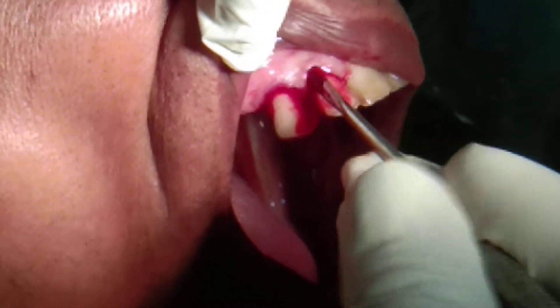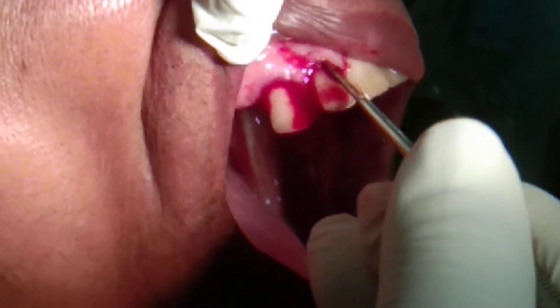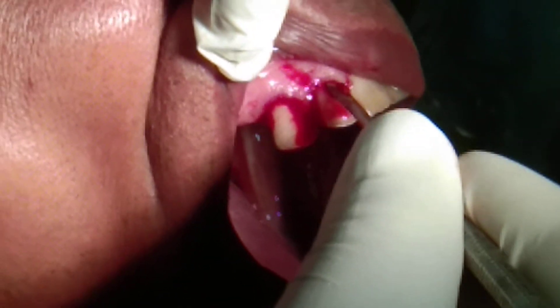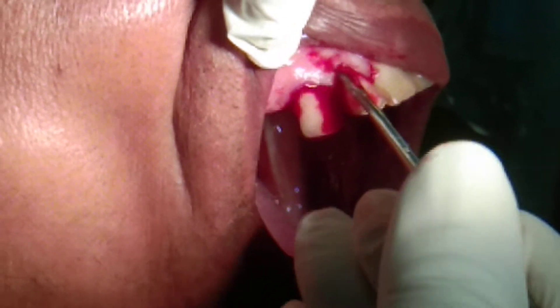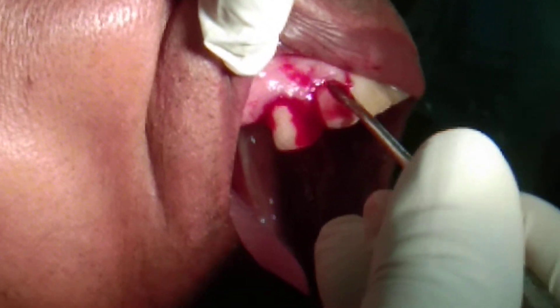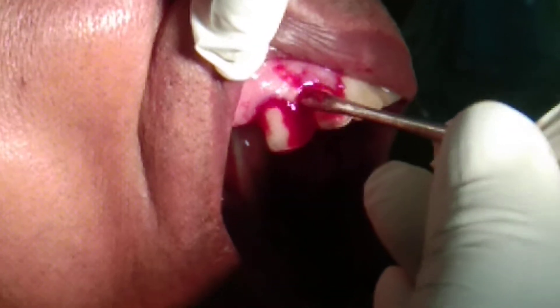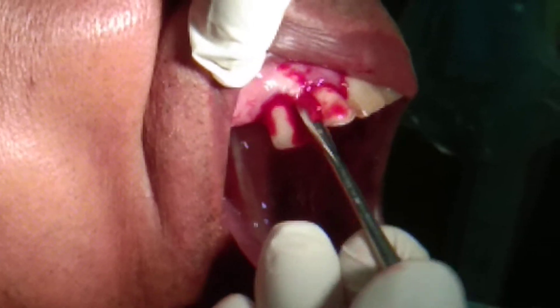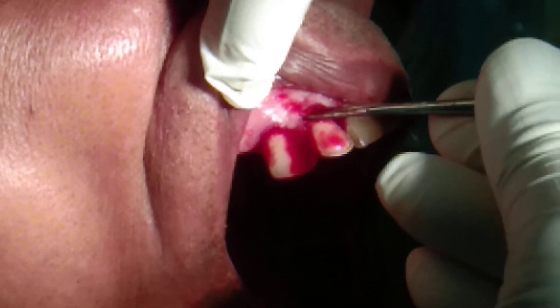Flap. This is a periosteal elevator. Once I have completely elevated — so I need to extract these two teeth — I am elevating the flap completely. This is the interdental col area and this area also I will be detaching.